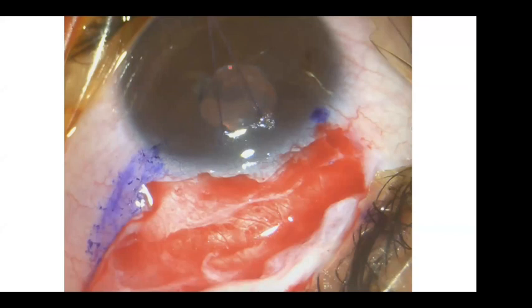And alternatively, we can place a corneal traction suture, which I think most of my colleagues and myself are doing nowadays. Corneal traction suture applied to the superior cornea, sometimes to the inferior cornea. But anyway, I think this is the one used nowadays, 7-0 Vicryl on a spatulated needle. And you can see the marks because before the operation, I do the marks.